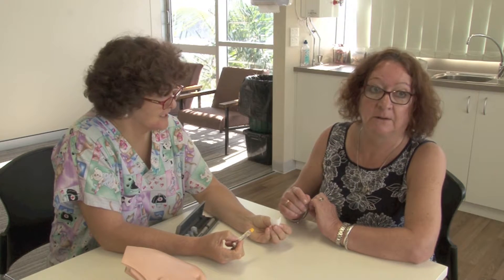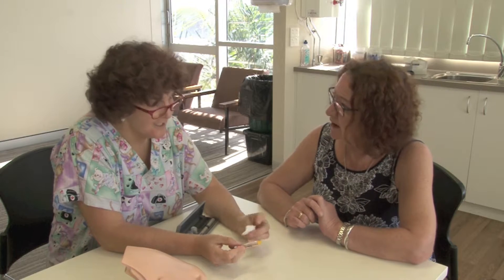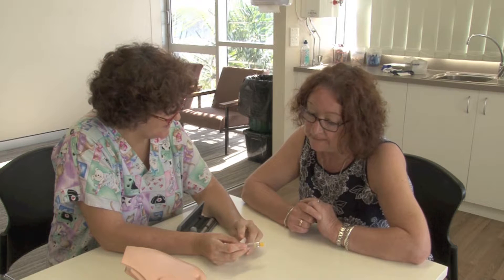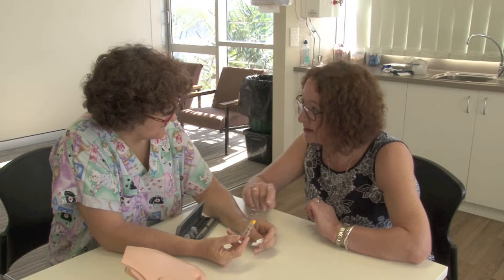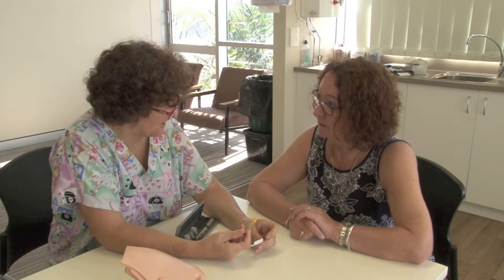I would think you're on about 12 or 15 units. Around that, yes. So if you're having 12 or 15 units twice a day, you would use this cartridge before it expired. So if there's still some left in it, I throw it out? You just throw it out — into a sharps container of course.